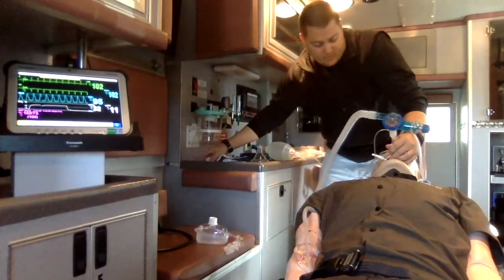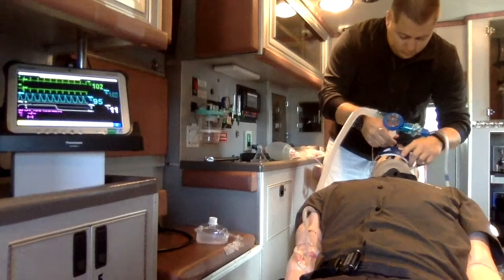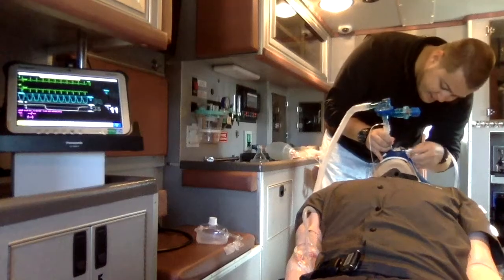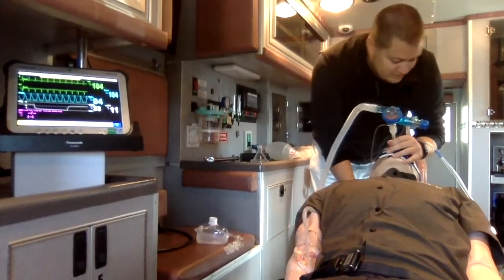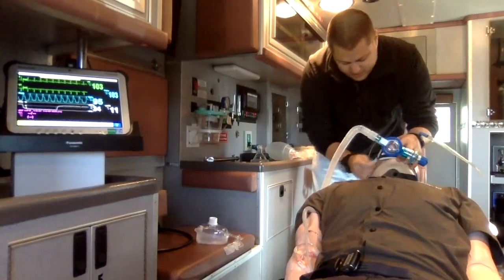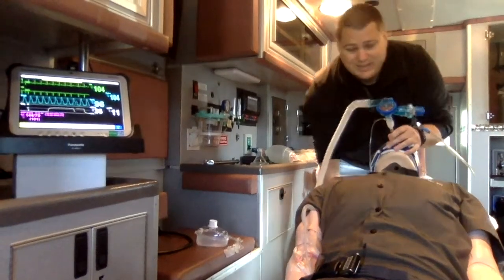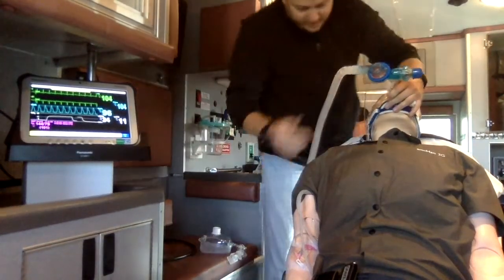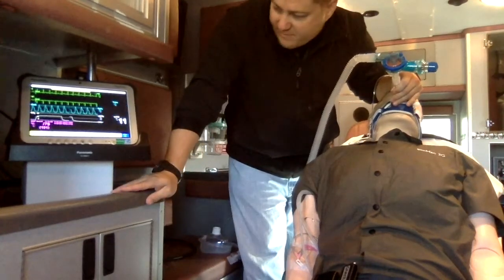We're going to recycle our blood pressures, see if anything changes on that end. Identify tube depth. Looks like it's about 25 at the teeth. Lung sounds were confirmed in all lung fields. End tidal shows me a good wave and good value, so we know we're secured in the trachea. Tube is secured. Again, I'm going to raise this individual to a semi-Fowler's position to help gravity keep that fluid as low as possible. Recheck on vitals here.